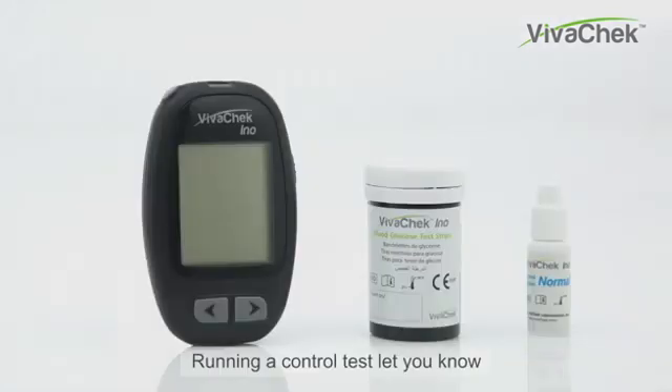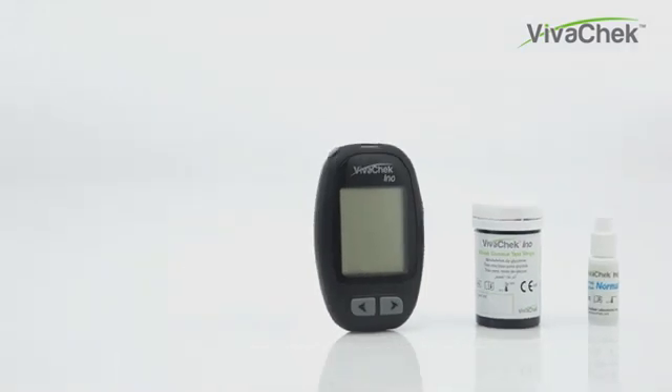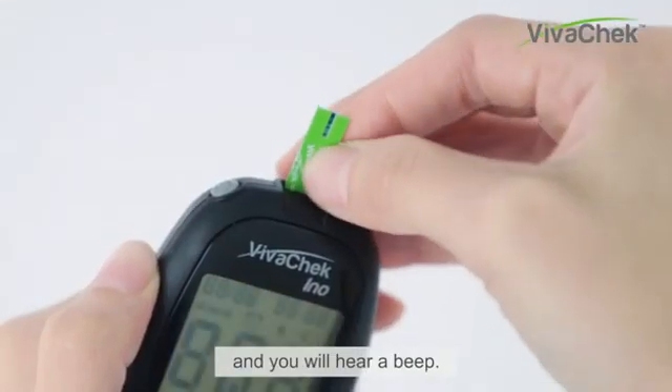Running a control test lets you know whether the meter and the test strips are working properly. You will need the VivoCheck InnoMeter, VivoCheck test strips, and control solution. VivoCheck has three levels of control solution. Insert a test strip into the meter and you will hear a beep.